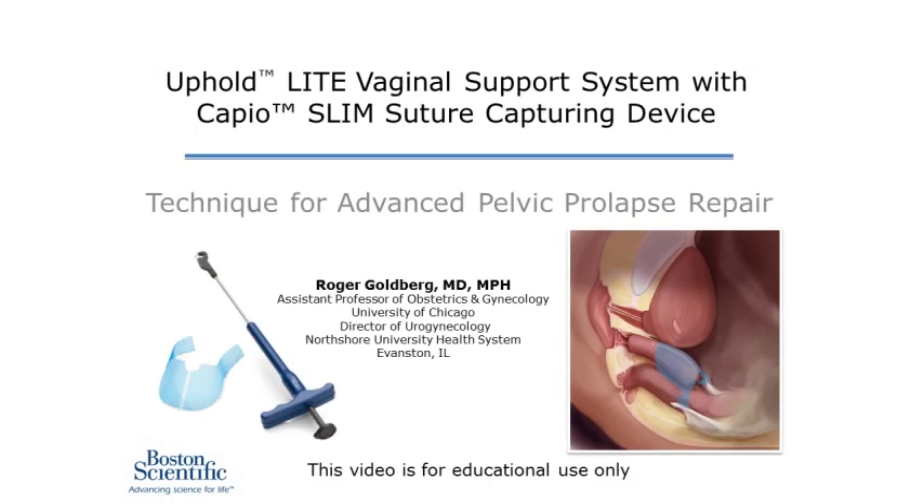In this video, we will demonstrate the use of an anterior apical mesh fixation repair using the Uphold Light System and the CapioSlim Suture Capturing Device made by Boston Scientific.